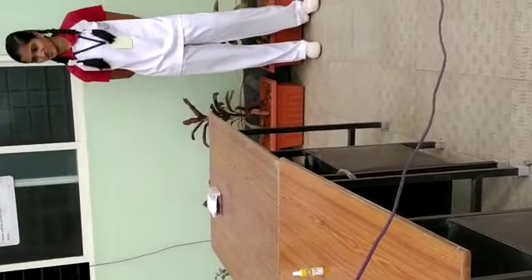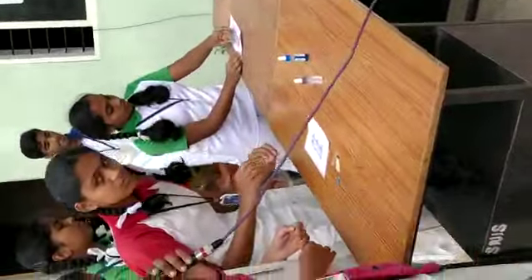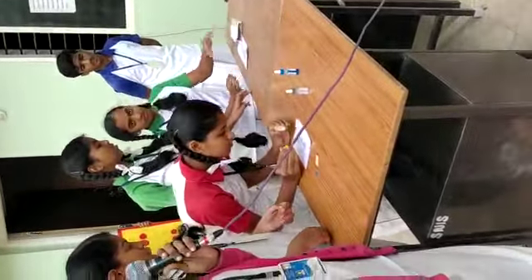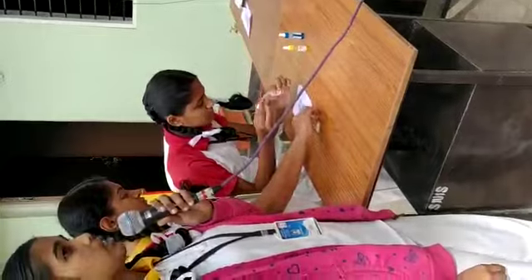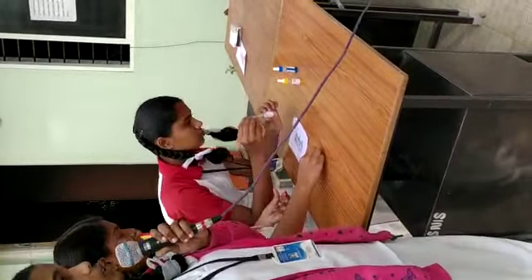Myself Rachana. My friends Revati and Prithvi are going to perform a blood test activity where Prithvi pricks Revati's finger so that her blood is used for the test. She has placed 3 drops of blood on a glass slide. Now she is adding antiserum A to the first drop, antiserum B to the second drop, and antiserum D to the third drop of blood.